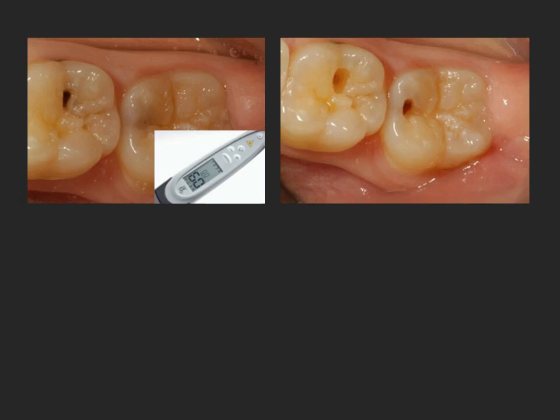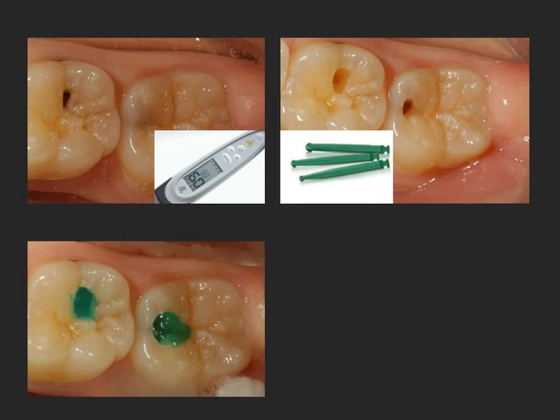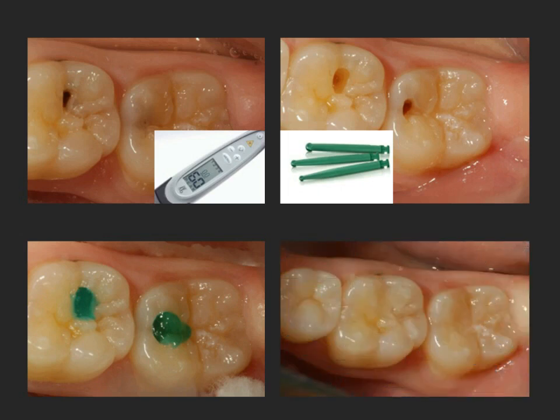Caries is excavated. I open up the caries lesion with the Fissurotomy burr, then use the smallest SmartBurs II to remove any infected dentin. And in this case, we use the acid etch protocol, bonding, and composite material to restore. And when we look at the restorations in the lower right, it's hard to even see where the teeth have been invaded in any way.